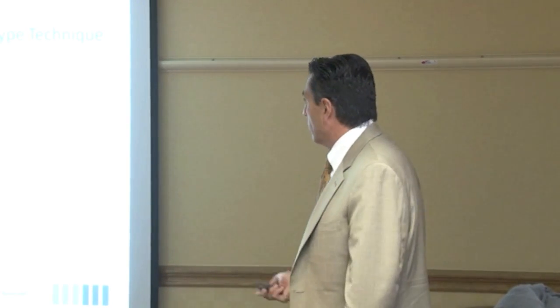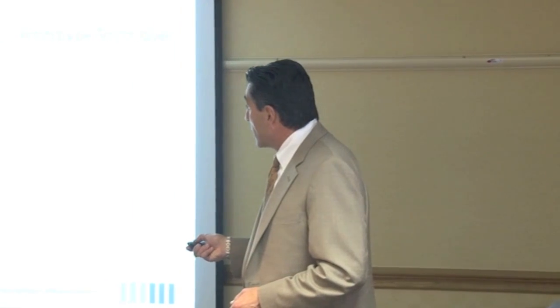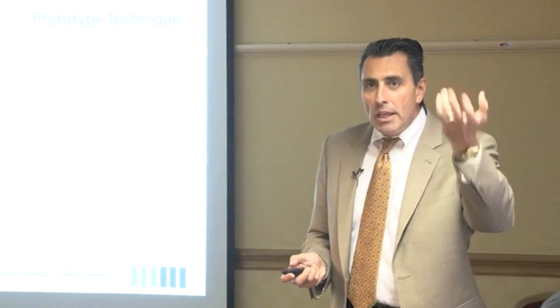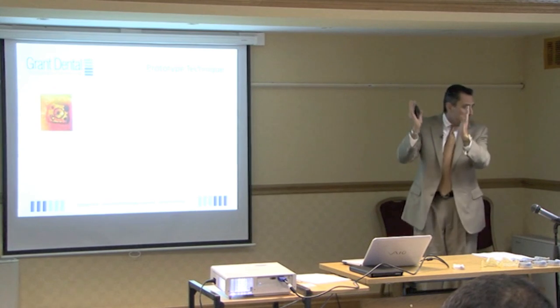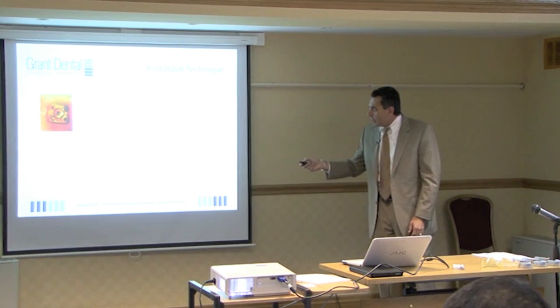And so we did a little study. So here's what we did. We developed this, our little platform, and you can see it here. And what we did was we took the OsteoSpeed Astrotech implant, because it had a nice angle to it that would fit through a hole in a platform.